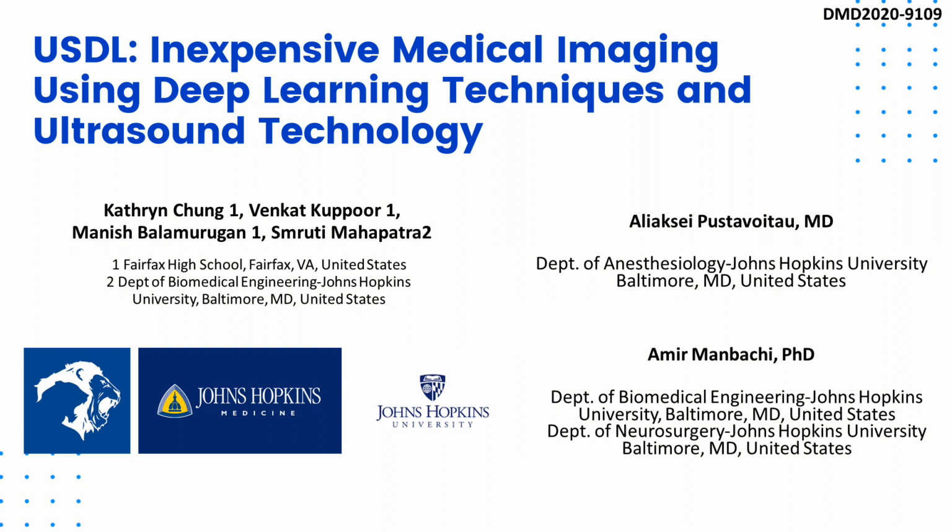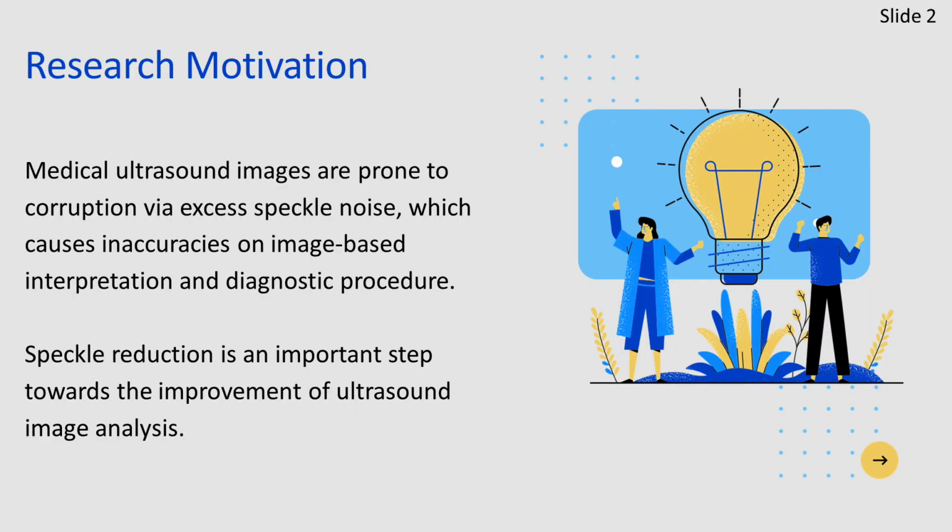Hi, in this presentation I'll be introducing USDL, short for Ultrasound Deep Learning, inexpensive medical imaging using deep learning techniques and ultrasound technology. Ultrasound, one of the most commonly used medical imaging modalities today, is recognized for its cost efficiency, versatility, and portability. Ultrasounds are used to diagnose many conditions. However, ultrasound imaging is merely a tool for initial diagnosis.